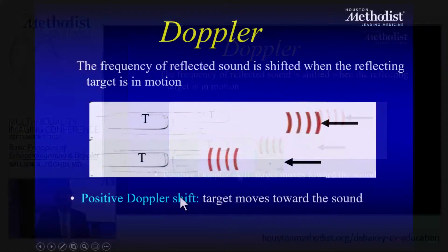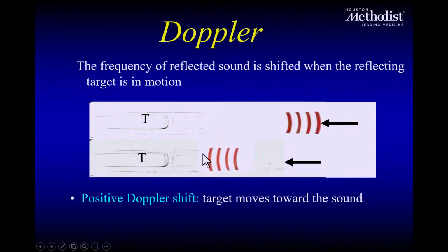So when we talk about the packet of ultrasound that we're sending, interestingly, these packets of ultrasound, or any sound actually, can be deformed depending on whether they interact with a moving object.